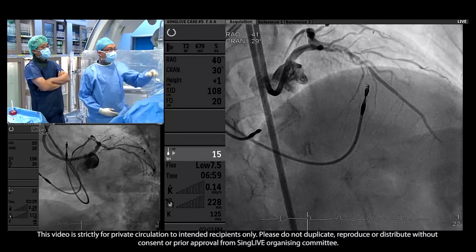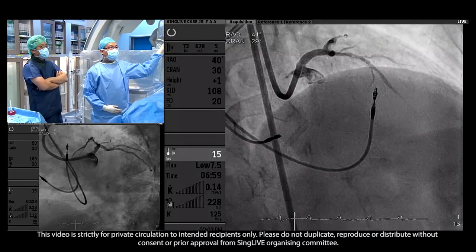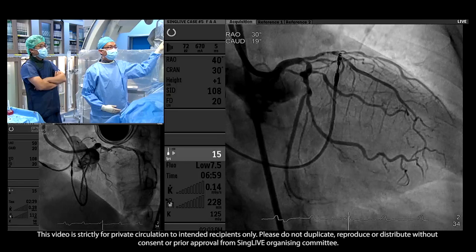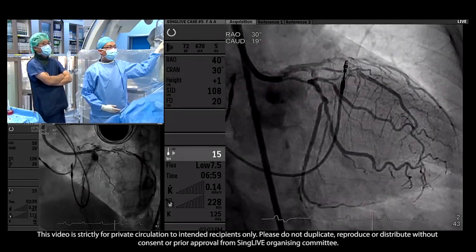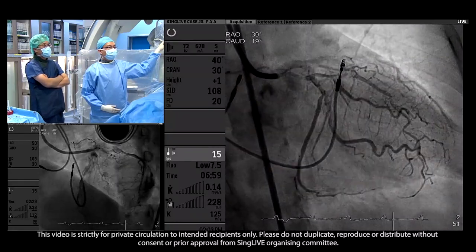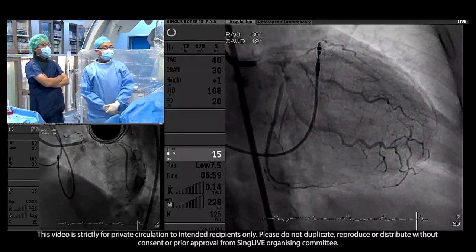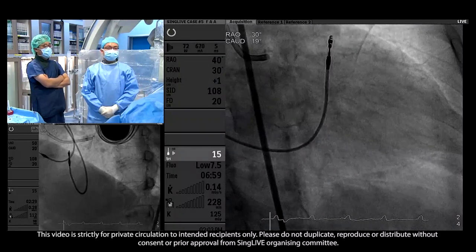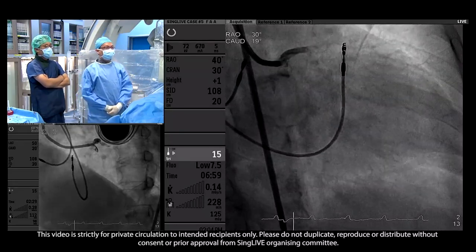Yeah, I think I agree that it's a very complex situation, distal left main. What we have to do, of course, is imaging number one. Then good preparation, at least with rota, because there's calcification there. And it's not only just rota. I usually use either a cutting balloon or a scoring balloon. It's a really complete modification, and that's to prevent side branch occlusion.